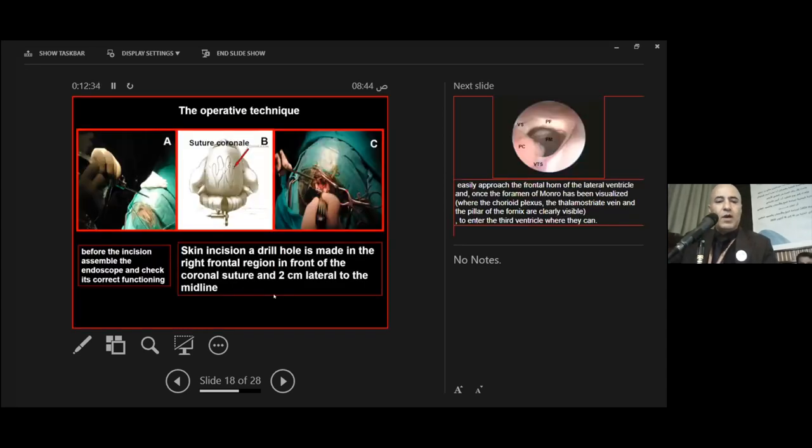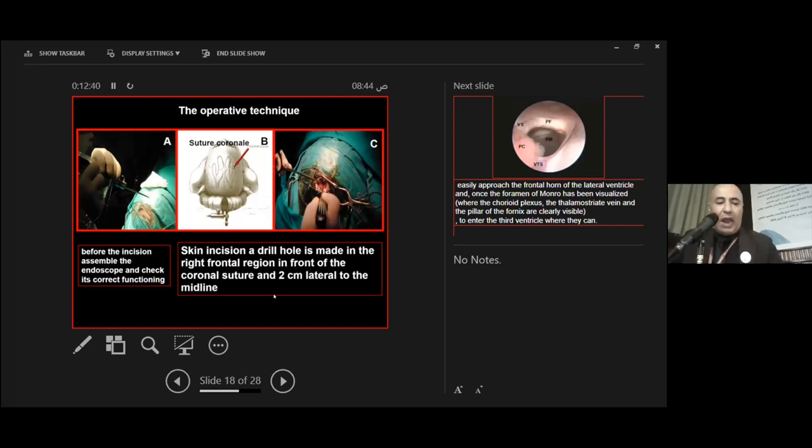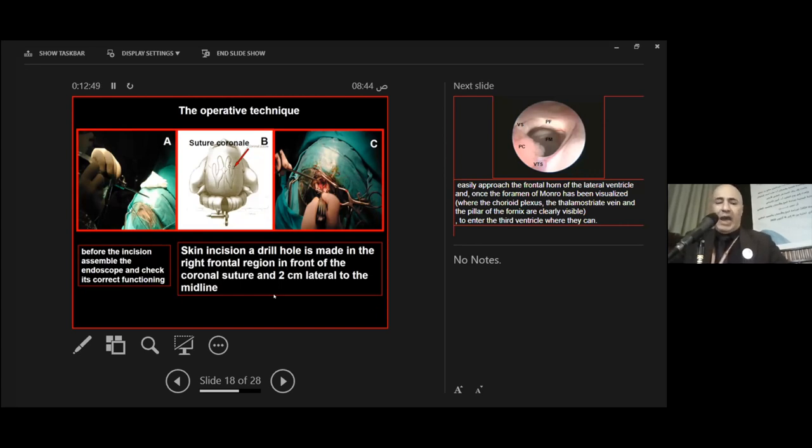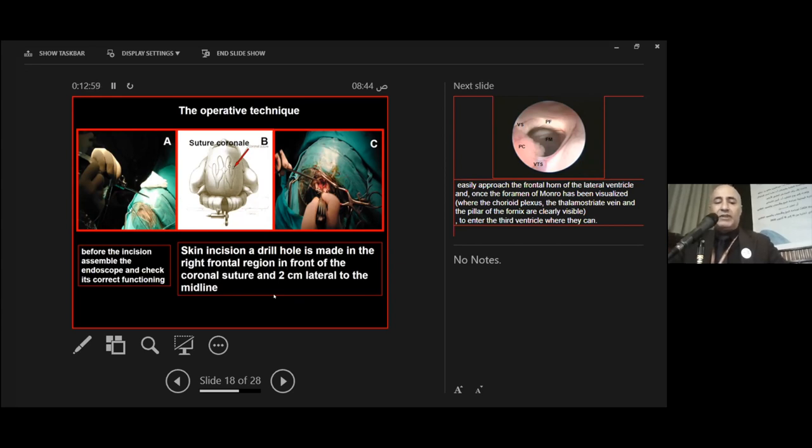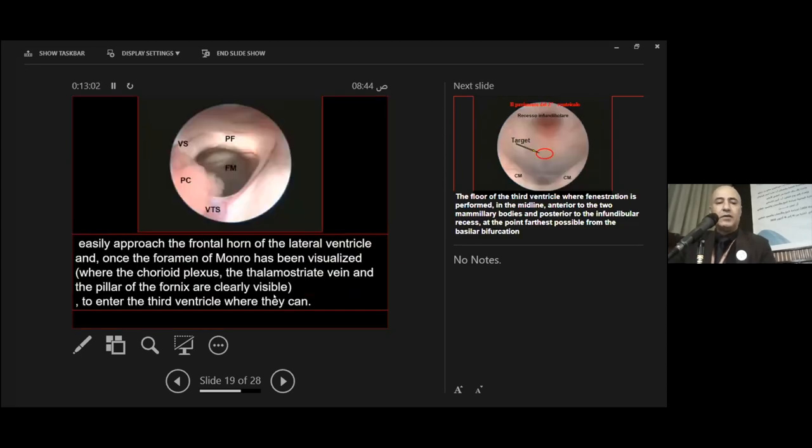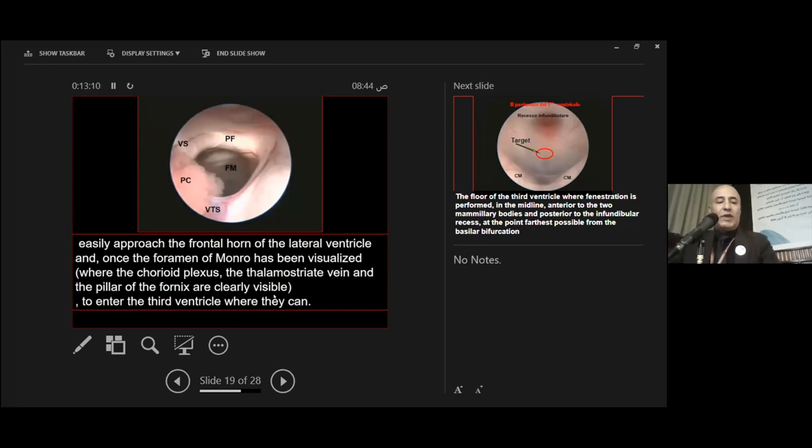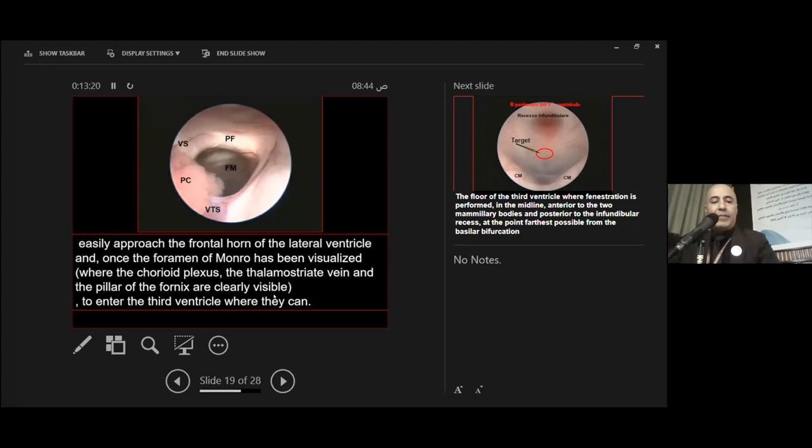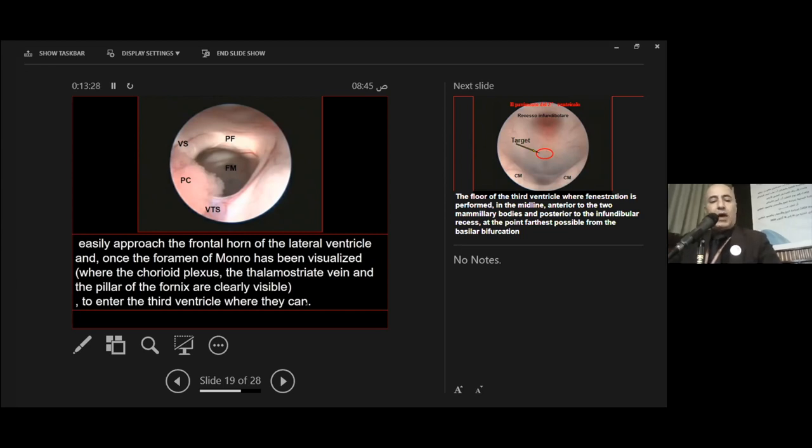The operative technique begins before the incision by assembling the endoscope and checking its correct function. A burr hole is made in the right frontal region in front of the coronal suture and two centimeters lateral to the midline. This is the approach to the frontal horn of the lateral ventricle. Once the foramen of Monroe has been visualized, the choroid plexus, the fornix, and the thalamus are clearly visible to enter the third ventricle.